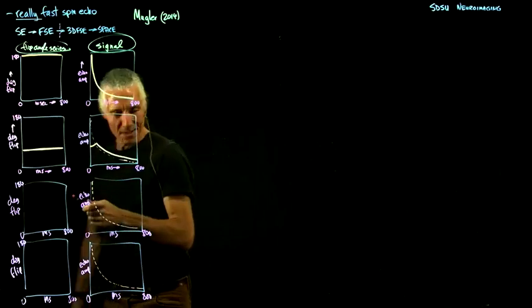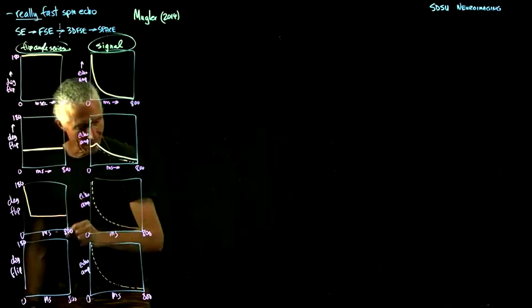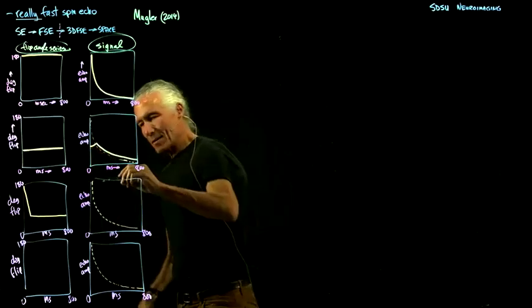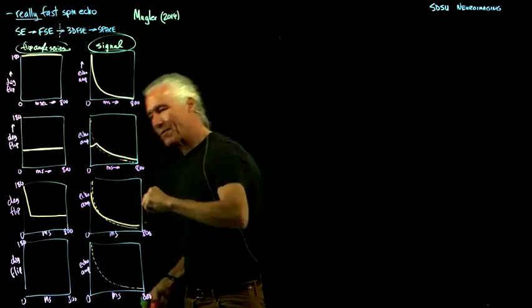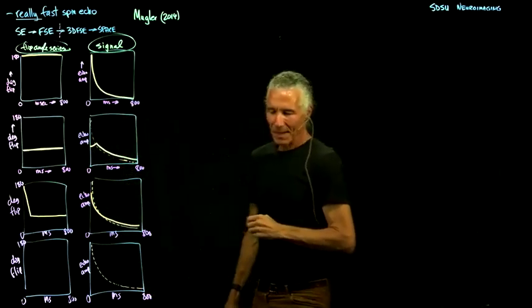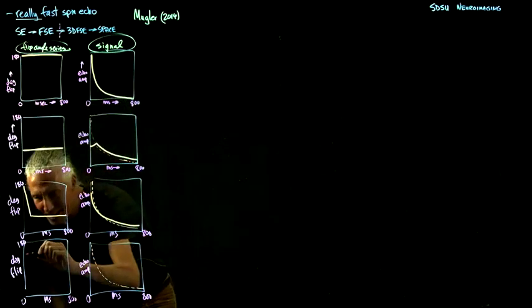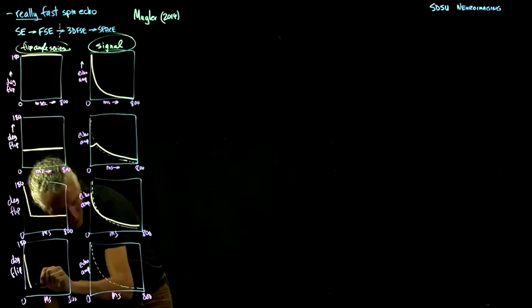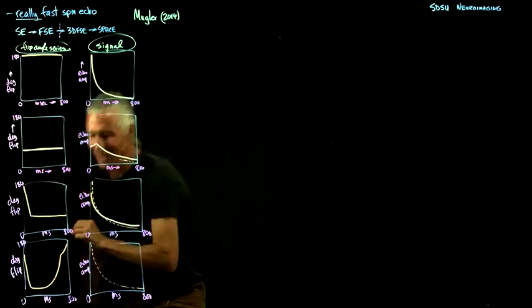And so then they said, well, what if you start off high and go down to a 60? Then you'll get rid of that little blip at the beginning, and you'll get something that sort of goes like this, but it still doesn't go out too far. And so what do they actually do in really fast spin echo? Just a complicated, optimized weirdness, like start up at about 120 and then go way down to about 30, and then come up like this and then at the end do a funky little thing like that.